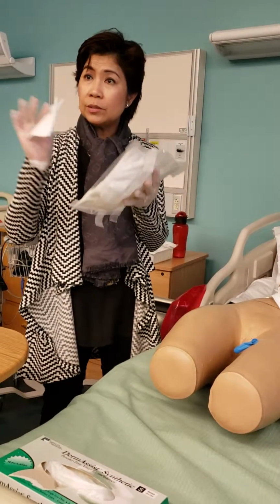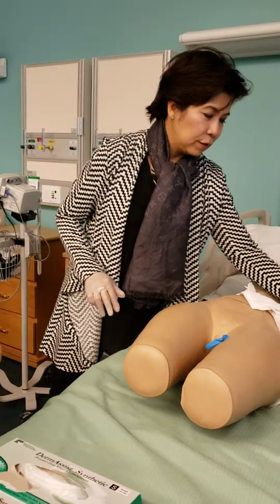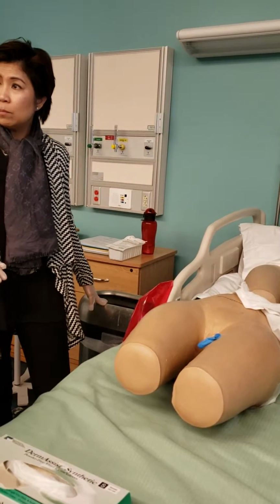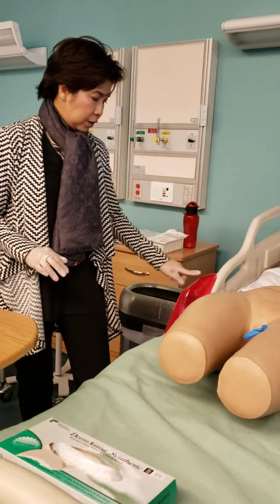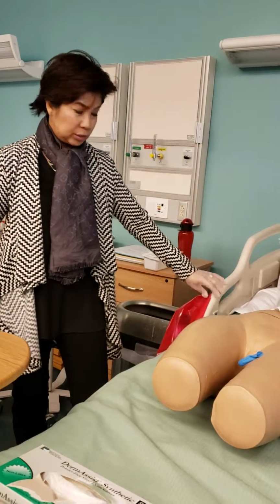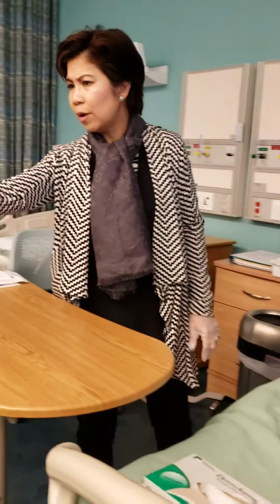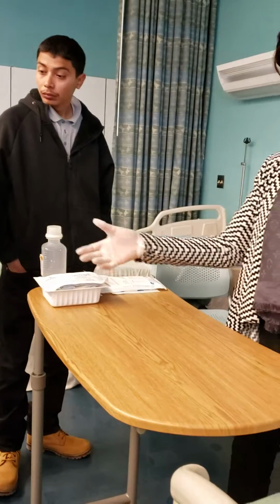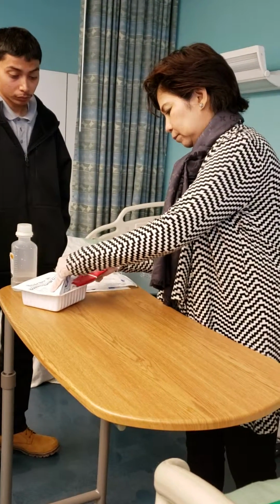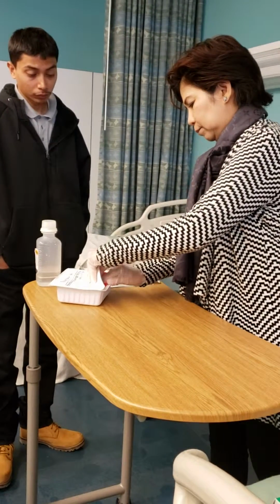Okay, this one is clean gloves, and then I throw it out. I'm not gonna throw it in because I'm gonna cover it up. So you throw that away. Make sure that you have your trash nearby. Okay, this one is in the dressing change tray, so I just left it here, but pretend this is inside. Okay, there's another one. Can you grab the other one, please? All right.